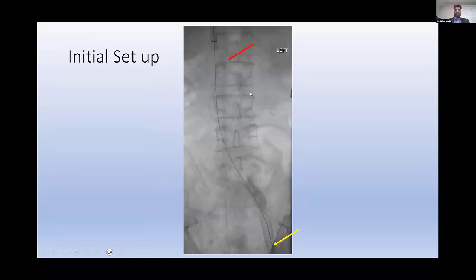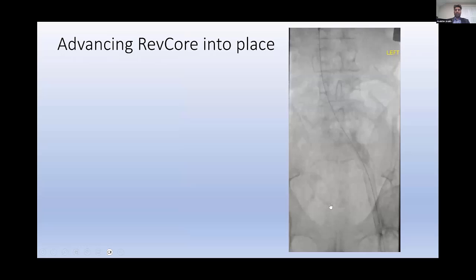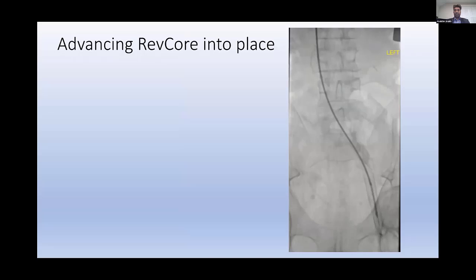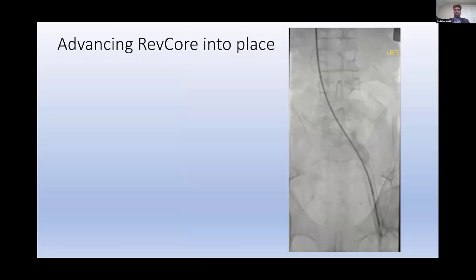This is my initial setup: the ProTree from above, through-and-through wire access, and the wire all the way down through the stent. As you advance RevCore into place — bringing it down from an IJ approach with no through-and-through axis — you work over a super-stiff Amplatz with that one-centimeter floppy tip. I took it sheathed through the filter, and it remains sheathed the entire way.